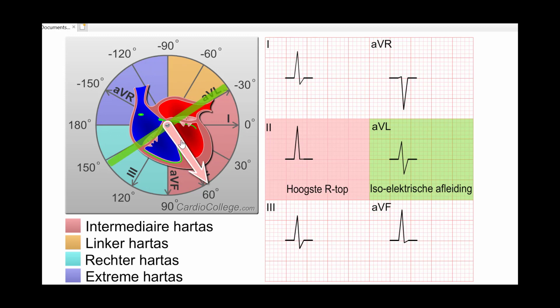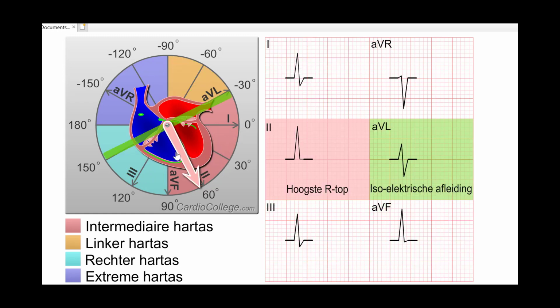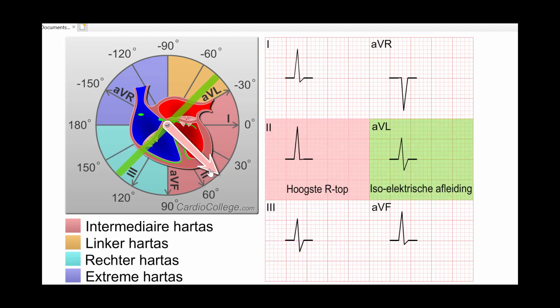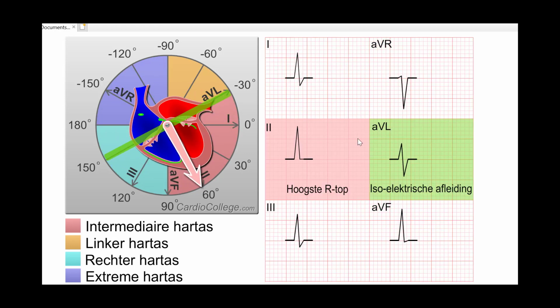All right, so there's this web app that allows you to look at this, and you can control the patient's electrical depolarization axis. So you can actually say, okay, I want a patient whose heart's depolarizing down or up, and then you can look at the way the ECG changes. So let's say our patient's heart is depolarizing down to the left like most people. You would expect lead 2 to have a very high peak. You would expect lead 2 to have a really strong signal.